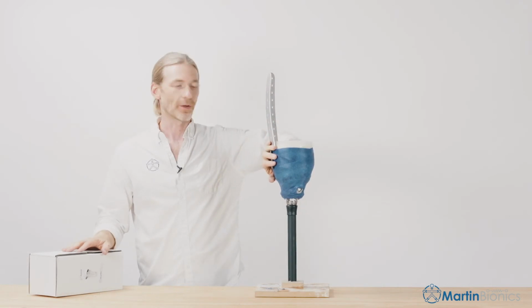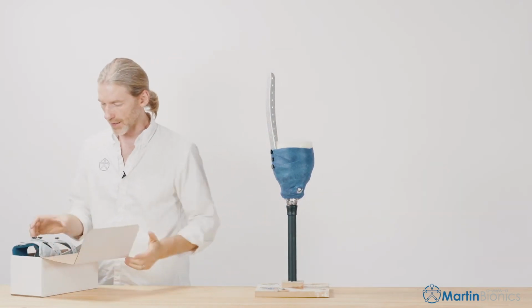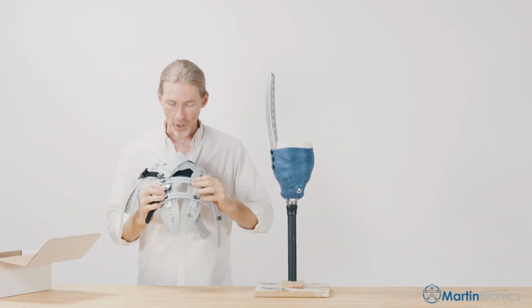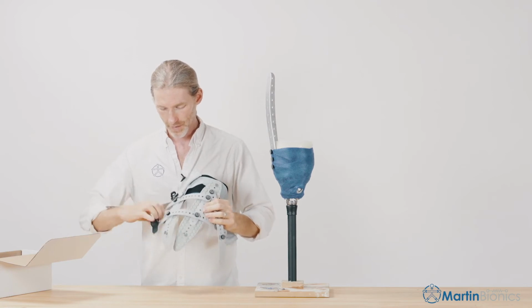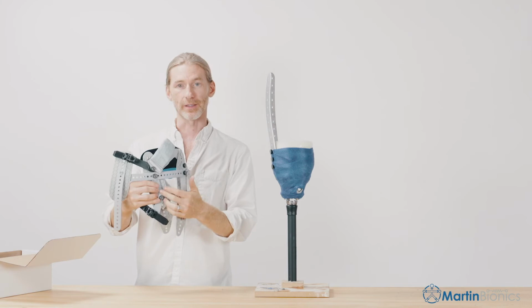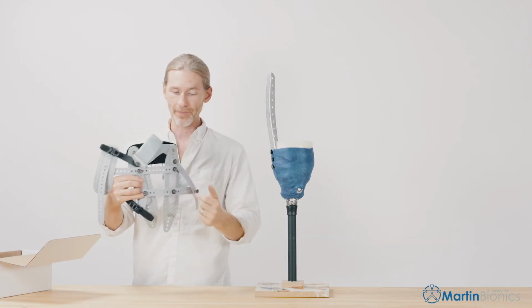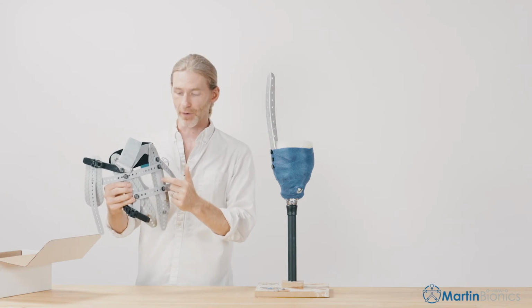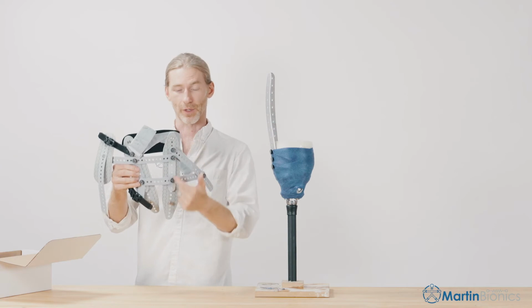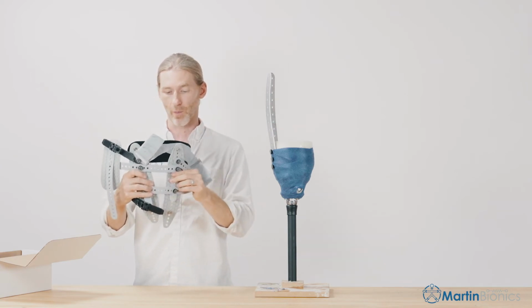Now that our 2 lateral anchor struts are affixed to the frame, we're going to open up our CX Hybrid, and this comes assembled. I'm going to place our 2 vertical struts, these 2 white struts right here. The anterior medial strut is going to sit, the proximal end, right over the adductor longus tendon running straight down. The posterior medial strut is going to sit, its proximal end, right under the tuberosity and come straight down. Now, while we're not rigidly supporting the tuberosity, positionally that's where we want them in space.